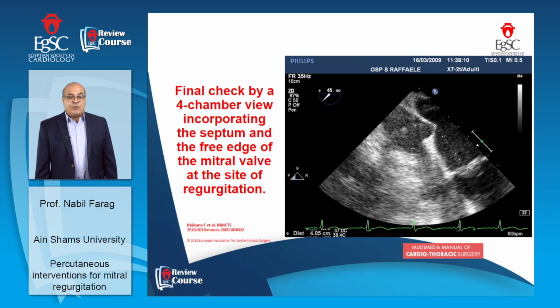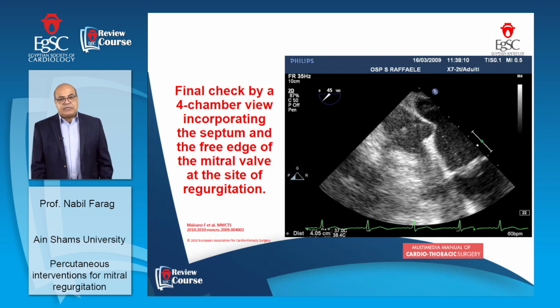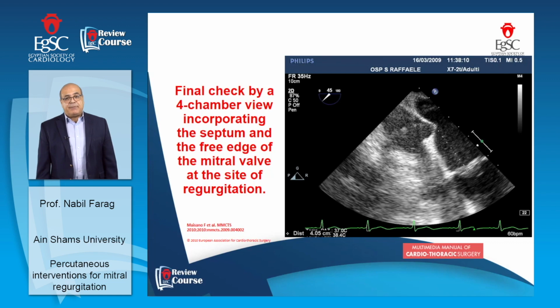Again, as we said before, in mitral balloon valvuloplasty, the site of puncture in the septum depends on the technique I'm going to use. In case of single balloon technique, like in Inoue, we have to puncture the septum a little higher in the fossa ovalis, and in double balloon, I have to puncture the septum a little lower to be close to the mitral valve.